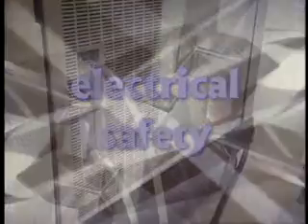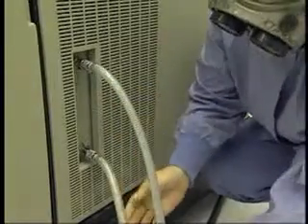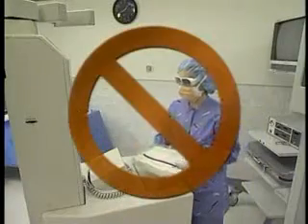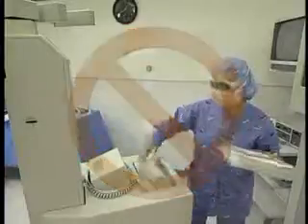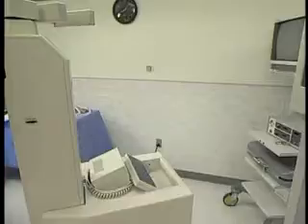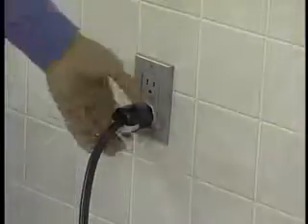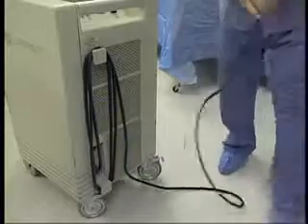Maintain a regular schedule of preventive maintenance and keep a written record of all services and repairs. Unplug the laser when it is not in use and remove the key. Immediately discontinue using the laser if it malfunctions and call service personnel. Detailed training in laser safety is the best preventative measure to ensure program controls. Laser safety officers and laser committees are responsible for creating and implementing policies and procedures that protect patients and personnel.